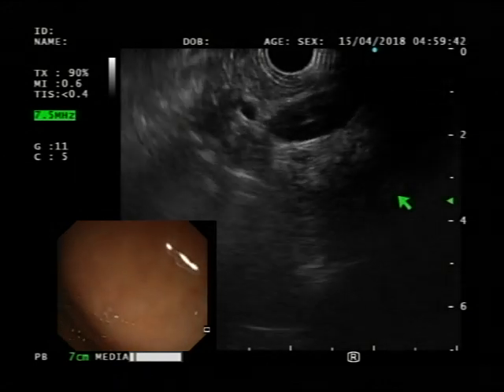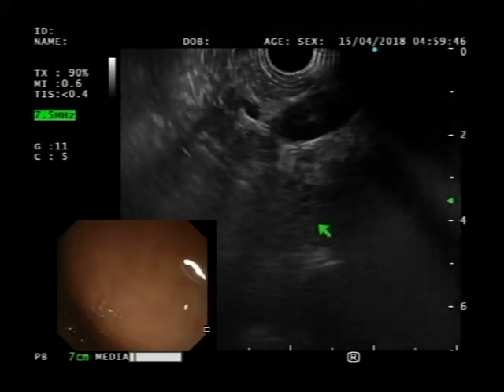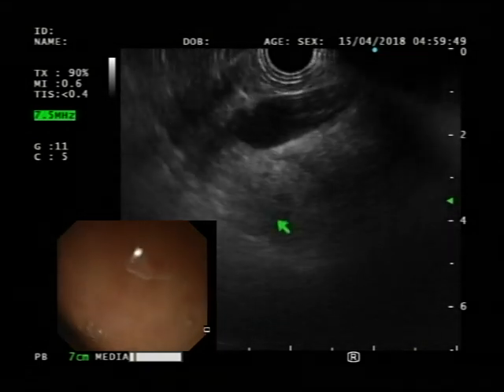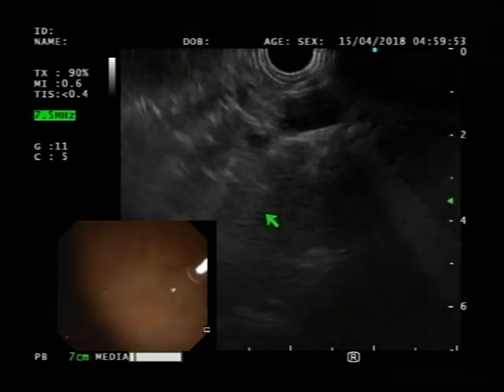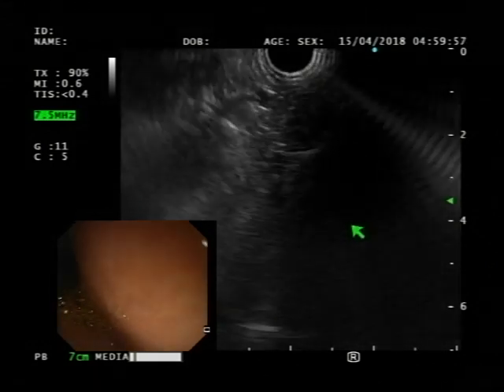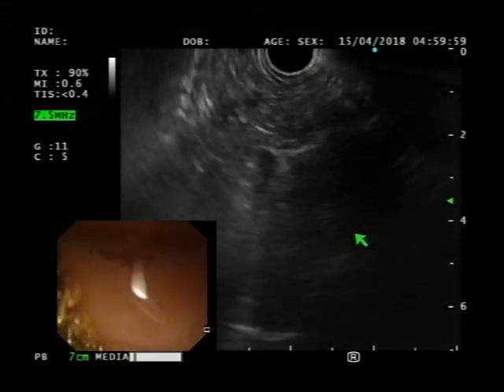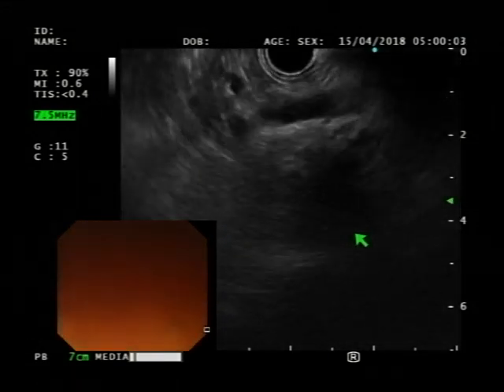And where would I expect the bile duct to be? Behind. So portal is going to go down this way, and bile duct will be down below it. Okay. Just go counter a bit. You might see it. Go the other way. The counter. Oh, I see. Let me just quickly do this. If it works or not, because it doesn't always work.